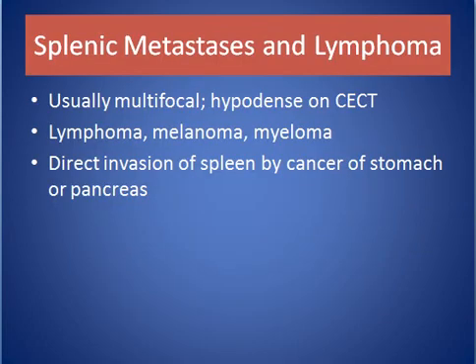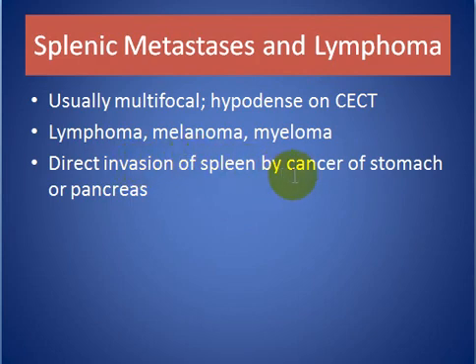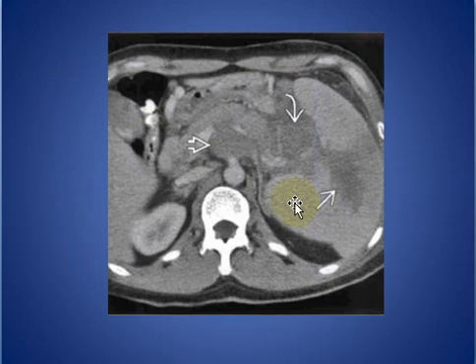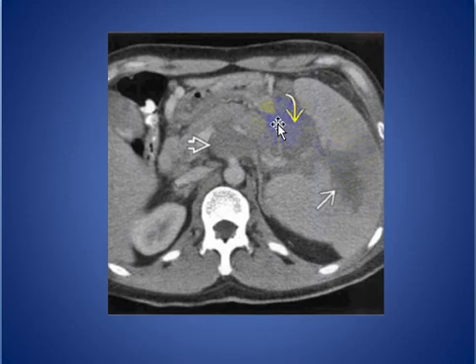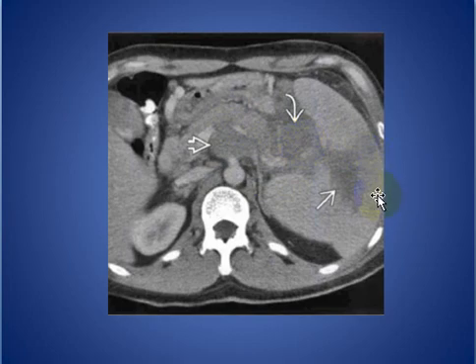Splenic metastasis and lymphoma are usually multifocal and hypodense on contrast-enhanced CT scan. Causes include lymphoma, melanoma, myeloma, and direct invasion by cancer of the stomach or pancreas. As seen here on axial contrast-enhanced CT, a heterogeneous mass within the splenic parenchyma and splenic hilum associated with abdominal lymphadenopathy in a patient with lymphoma.